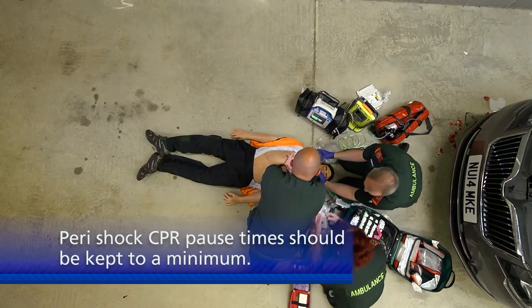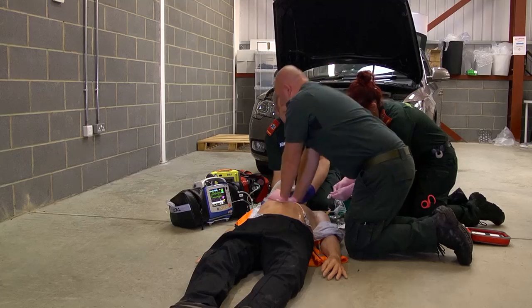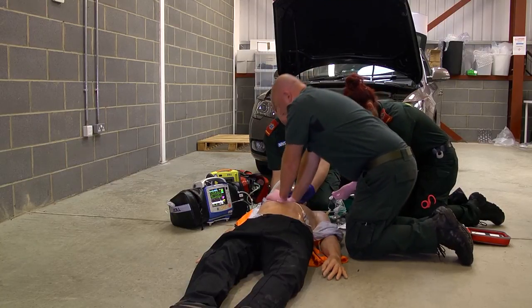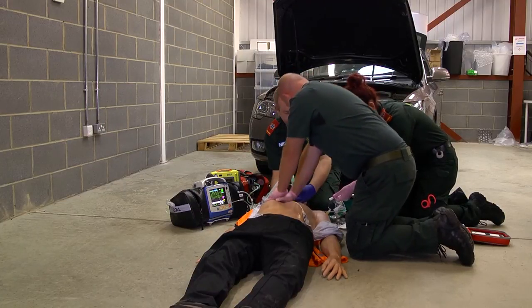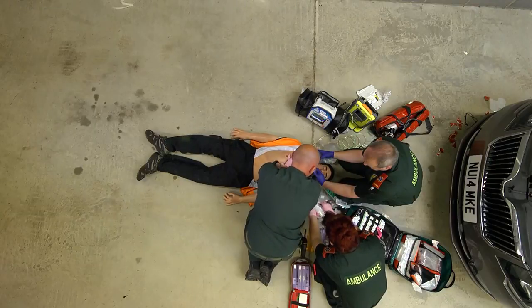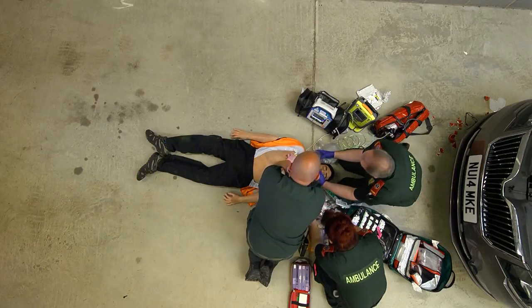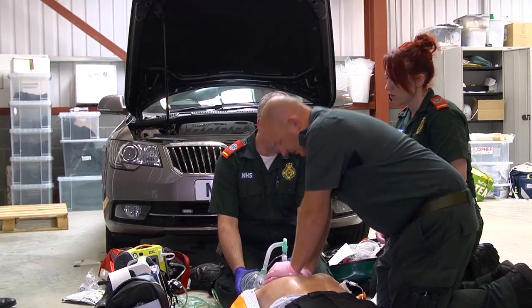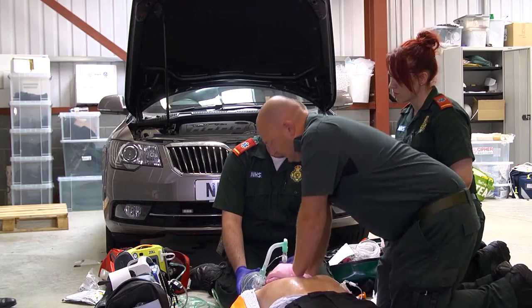Yes. Okay. So let's have, yes, 150 on another one as well. Yeah, so that's the adrenaline. Yeah. Half of the amiodarone, 150. Yeah. Excellent, that's great. Okay, so that's the fifth shock delivered, and you've just given the second round of amiodarone, yes? In that case, it looks like this patient's still in VF.